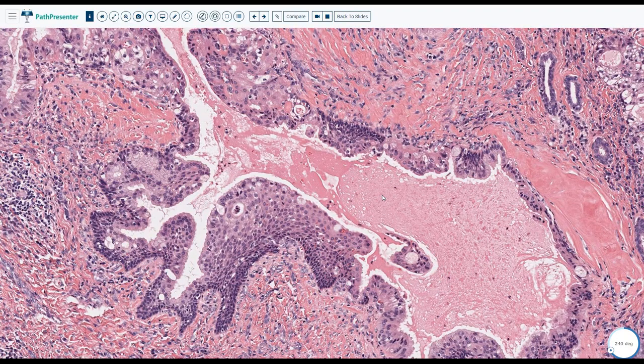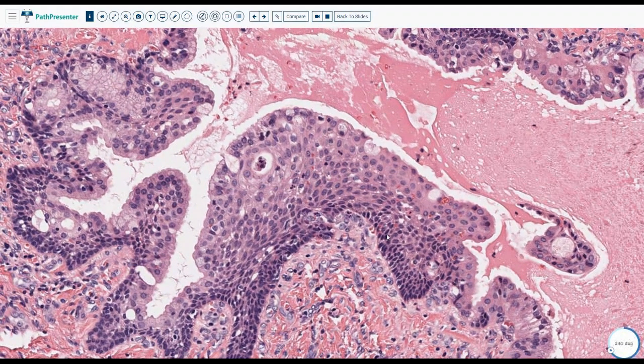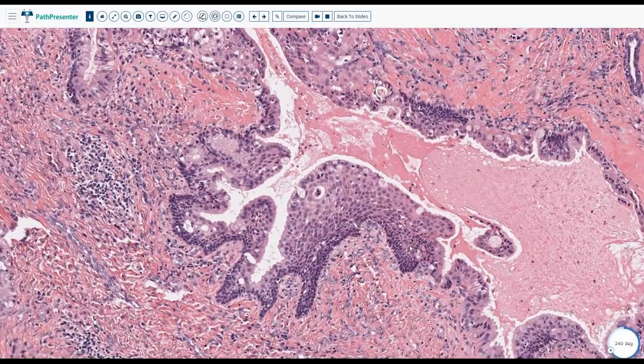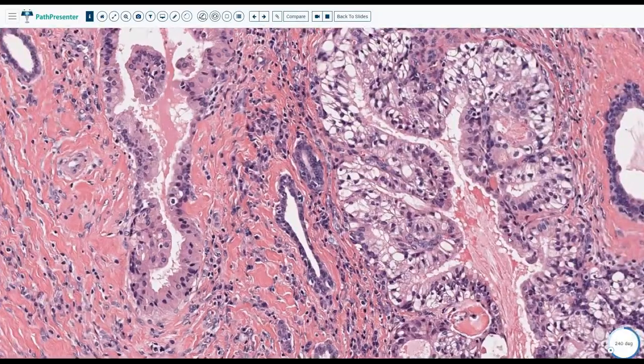What are the cells in the middle between the mucocyte and epidermoid cells? What do we call them? Excellent. We call them intermediate cells. Some of the pathologists, the experts, are not that convinced and don't believe much in intermediate cells.